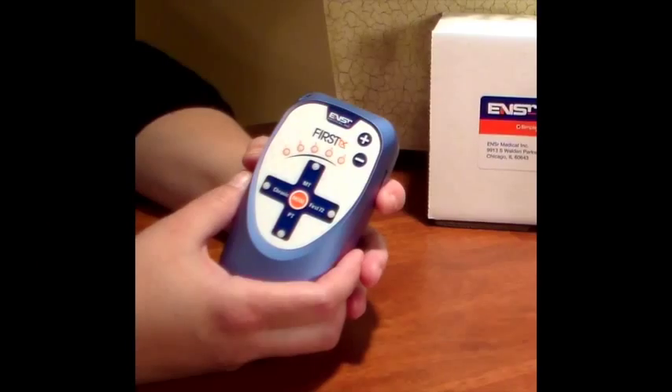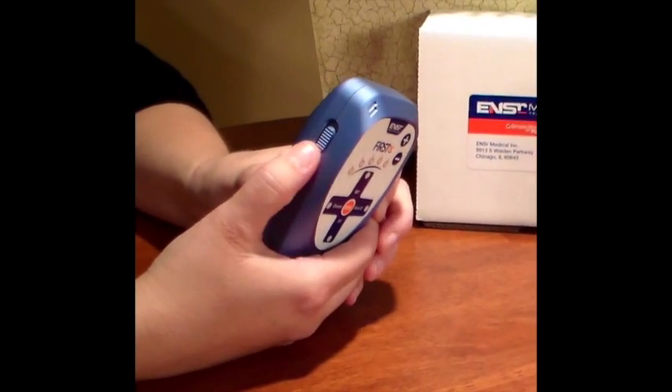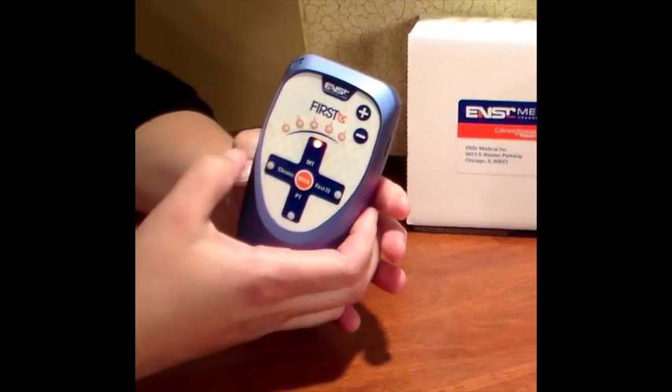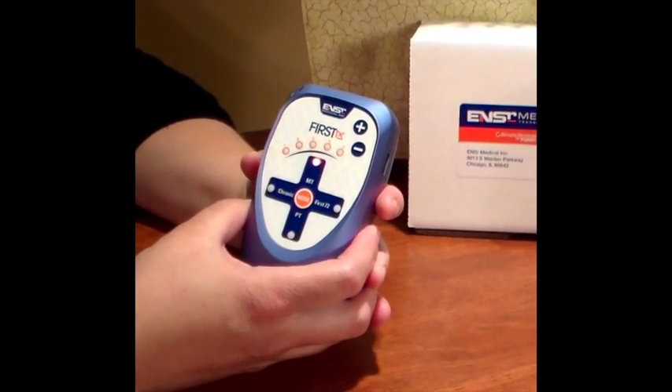Now I'm going to show you some of the basic functions of the device. The on-off power switch is located on the side. When you slide it up, a beep and an illuminated light will let you know that the device is functioning.